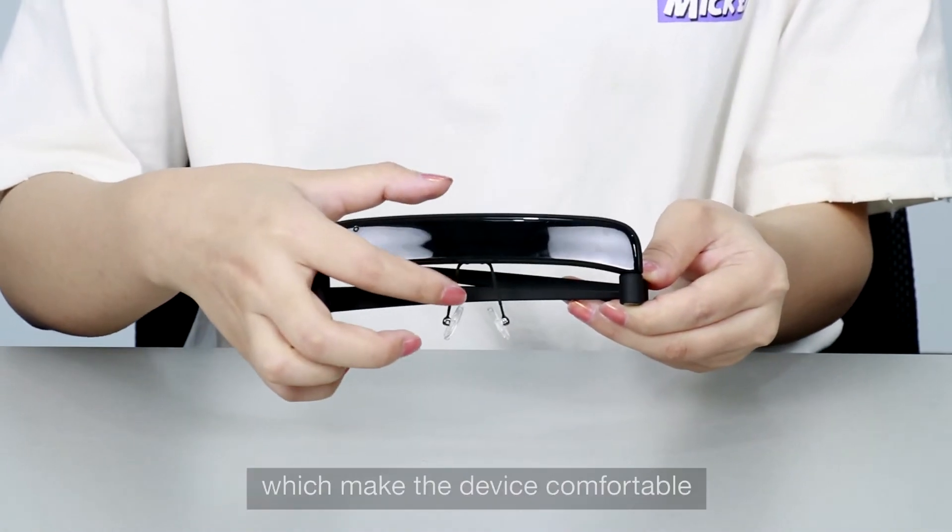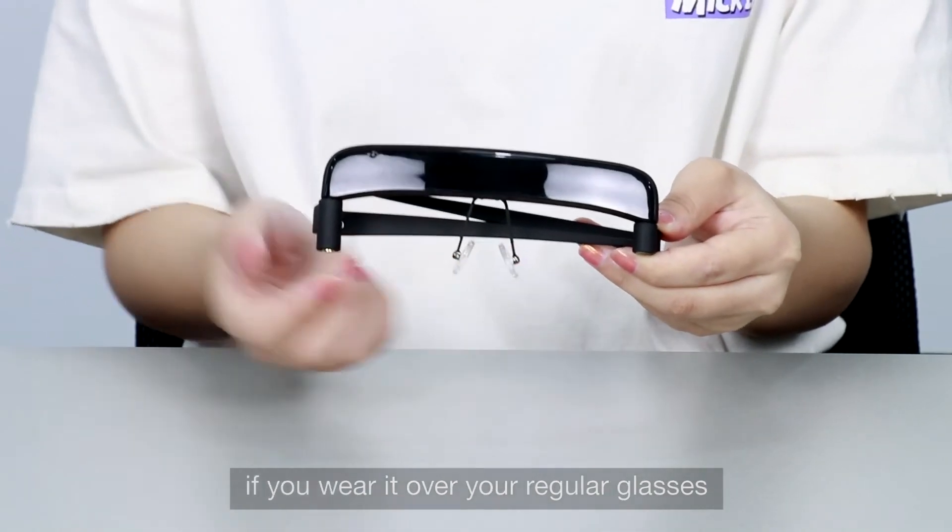Glasshouse has long nose pads, which make the device comfortable if you wear it over your regular glasses.